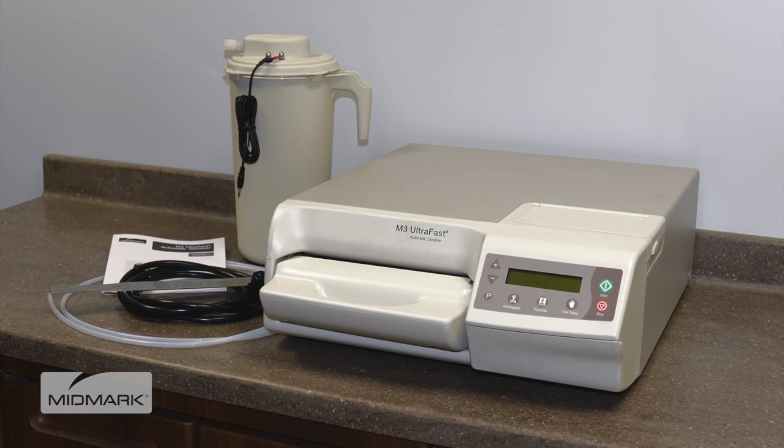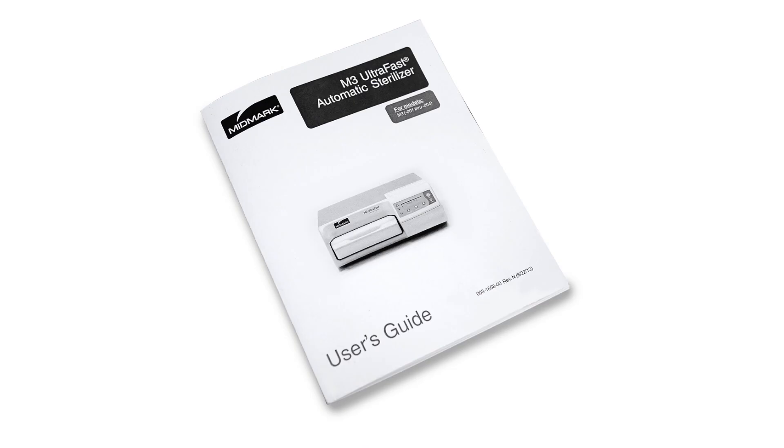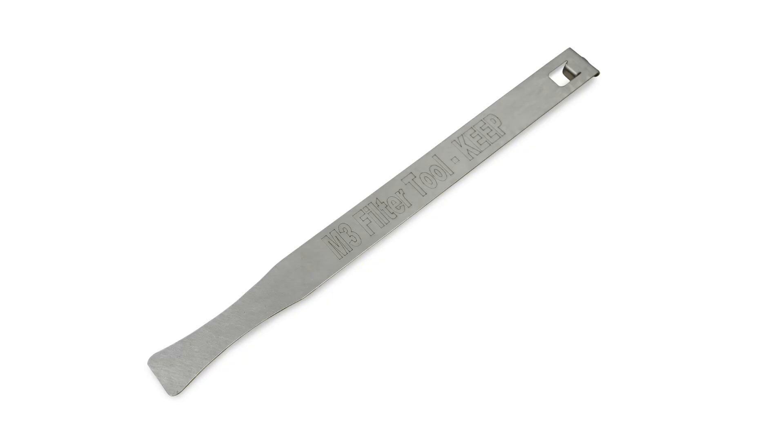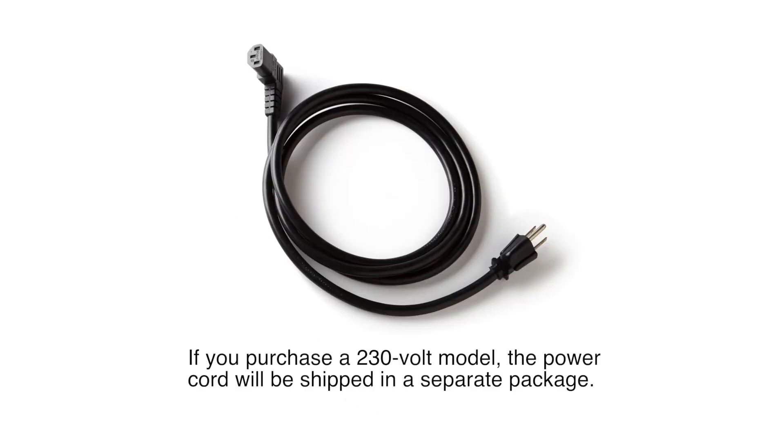Included with the M3 Ultrafast automatic sterilizer purchase, you will find the M3 Ultrafast unit, M3 User's Guide, Quick Reference Guide, User Training CD, Filter Change Tool, Drain Hose, External Condensing Tank and Tubing, and a Power Cord.